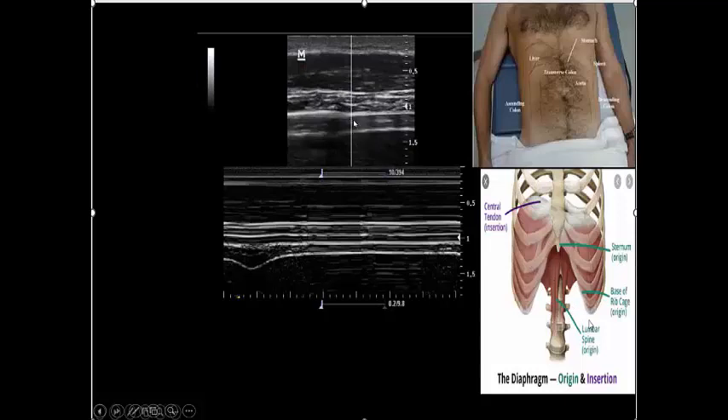The diaphragm is composed of three parts: the superficial part is the pleural lining — this echogenic line — the middle part is the diaphragm itself, and the deep inner part is the peritoneal lining. Here is the liver, and above the liver is the lung. Once I reach this beautiful picture of the costal part of the diaphragm, I will apply M-mode.